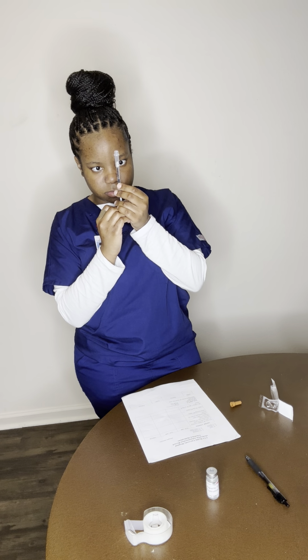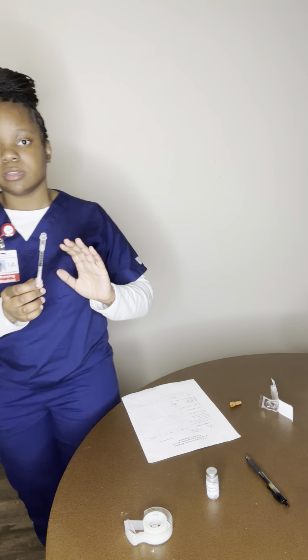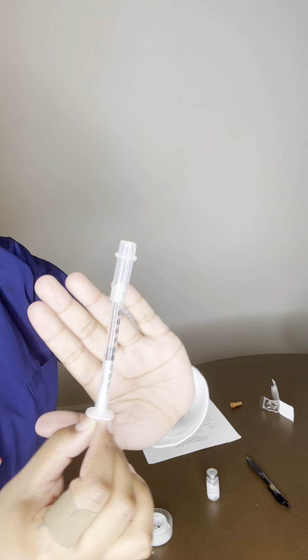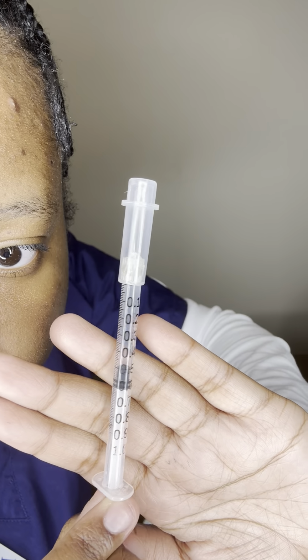Okay. So as you can see, I have 0.5 milliliters of air aspirated to the syringe.